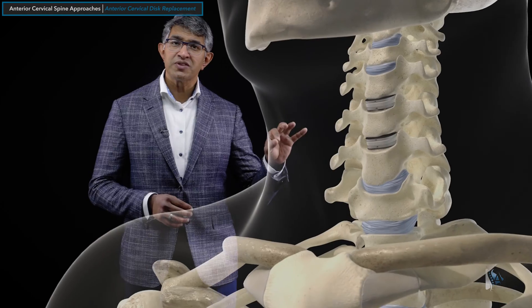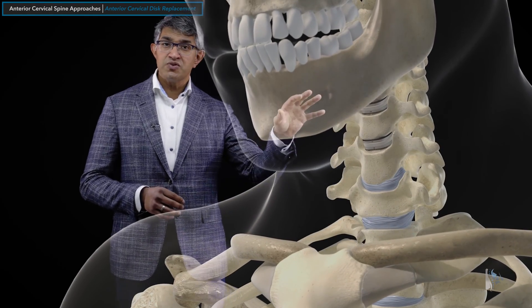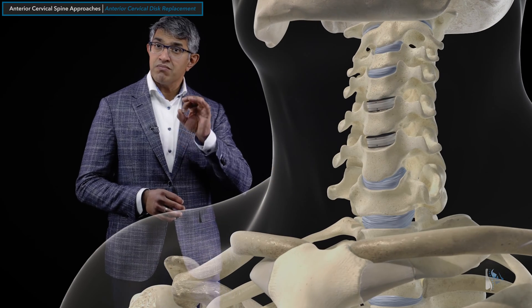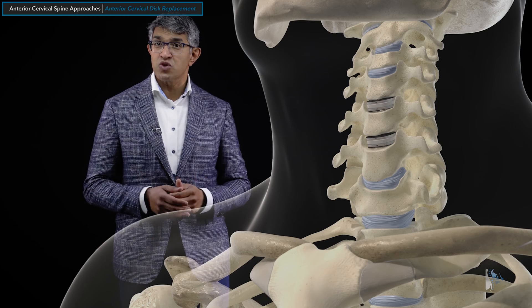What's so powerful about this technique is that these devices are designed to move. With forward and back flexion, extension motion, and turning to the side, these levels still move. This is a motion-preserving procedure, which is part of the reason that it's so powerful.